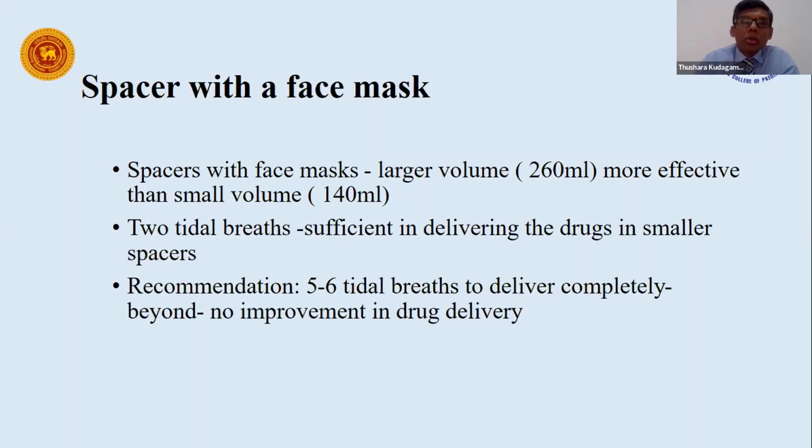Usually about 2 tidal breaths are sufficient to deliver the drugs, but the recommendation is going up to 5 to 6 tidal breaths. That will empty the drugs in the spacer. Going beyond that is not that helpful, because there will be no significant improvement in drug delivery.